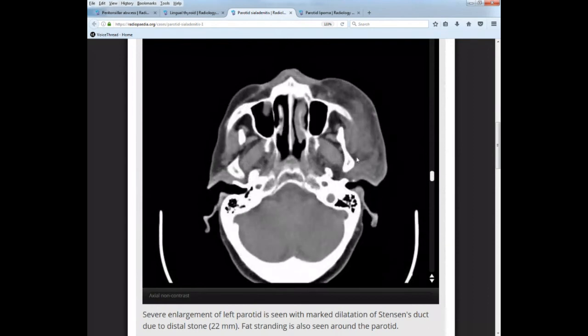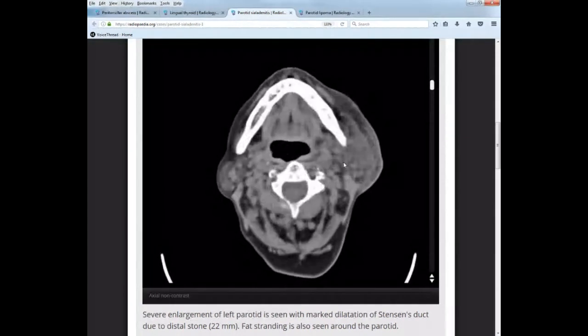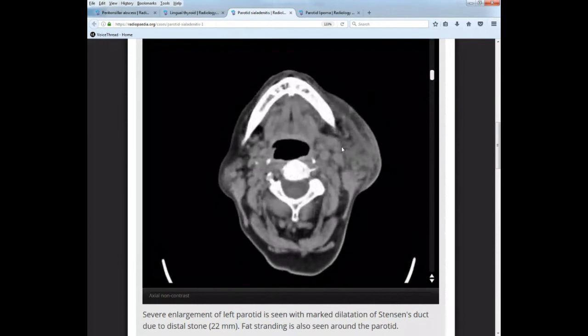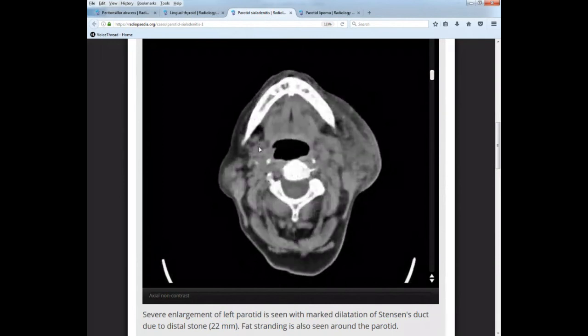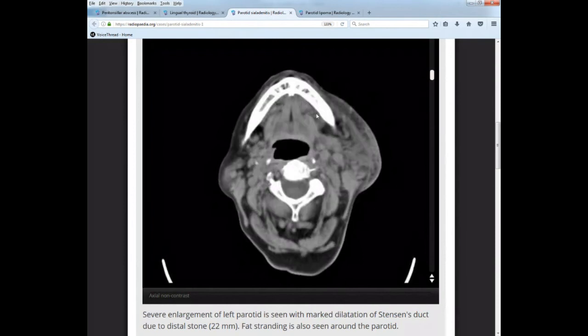Okay, the next gland we need to look at is the submandibular gland. Submandibular is going to be just medial to the mandibular rami. It's going to look glandular again, and you can kind of see on this side, it's easier to see here. This one is over here. So here's your right, here's your left submandibular. And then up in here, a little bit lower, you're going to kind of see some glandular tissue in here. That's your sublingual glands in here, just under the tongue.